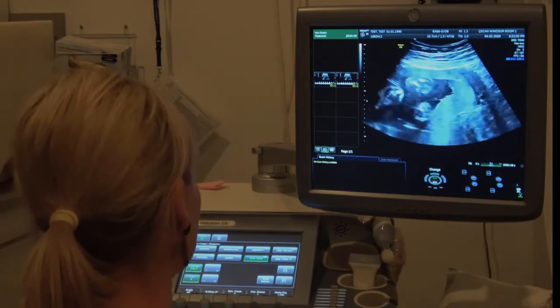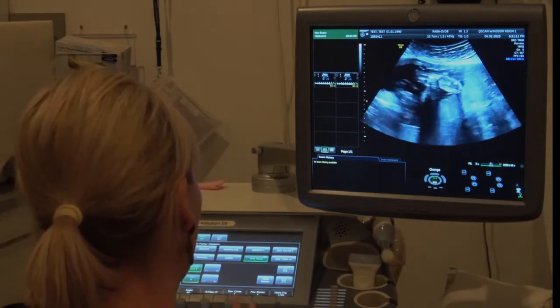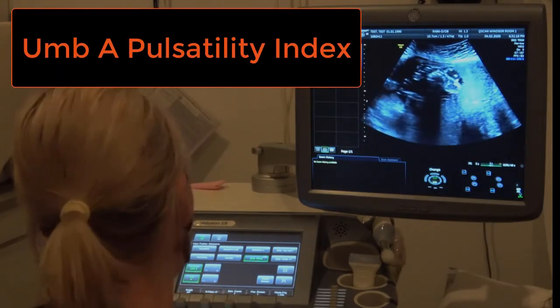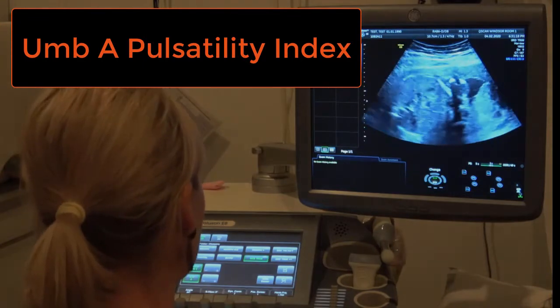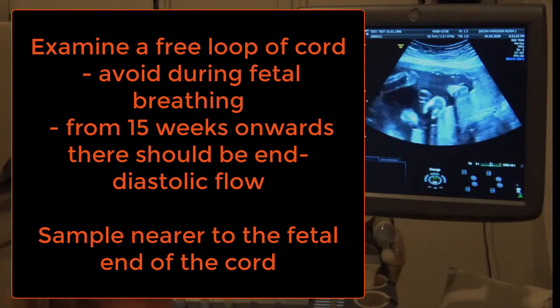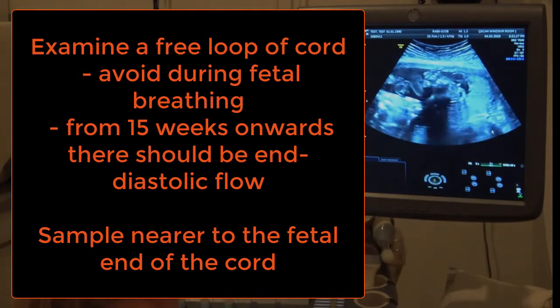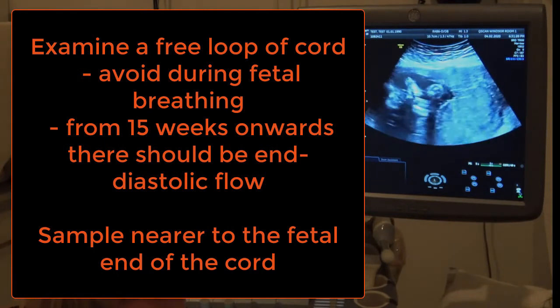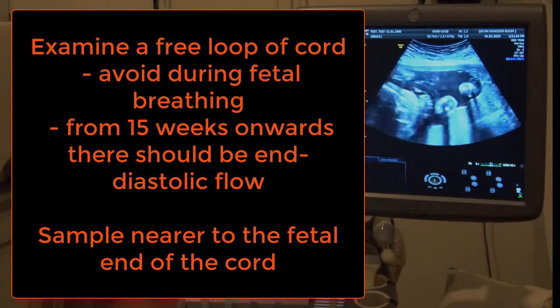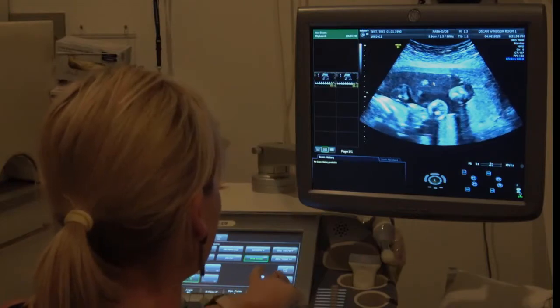You're not going to get that lovely trace. For the umbilical artery, I guess most of you would know, you don't take it too close to the placenta. That's the low resistance end. Don't take it too close to baby's belly. That's the high resistance. You need one in the middle, a free loop, one that preferably baby isn't kicking. You don't really have to find where it inserts into the placenta and trace it back. You can just see that this part here is in the middle and should be okay.